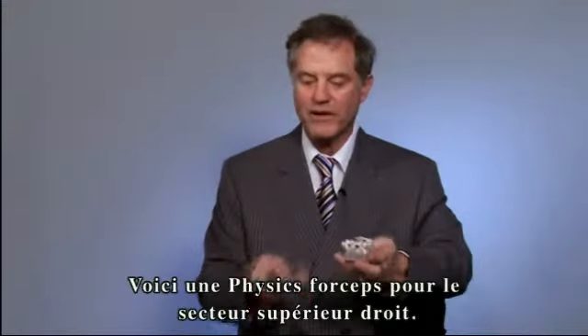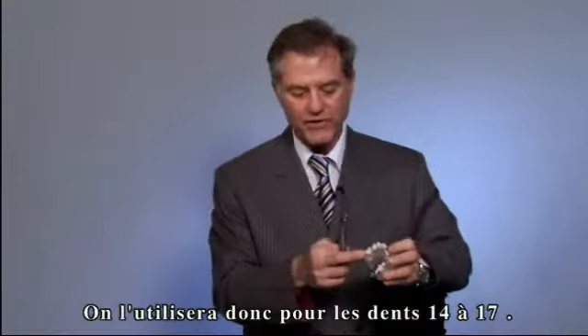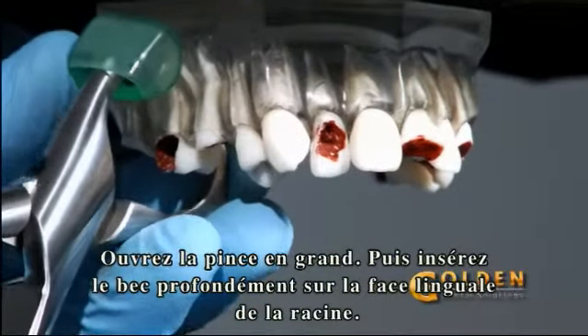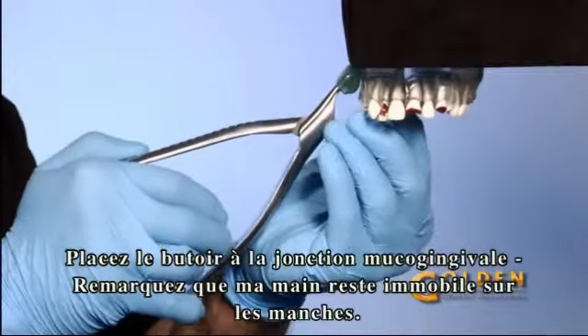I'm going to take an upper right physics forcep. This is basically used on teeth two, three, four, and five. First, open the instrument wide. Then engage the beak deep on the lingual aspect of the root. Next, set the bumper at the mucogingival junction.